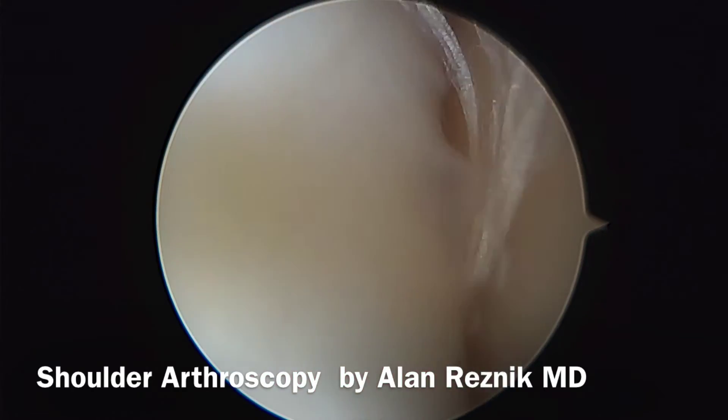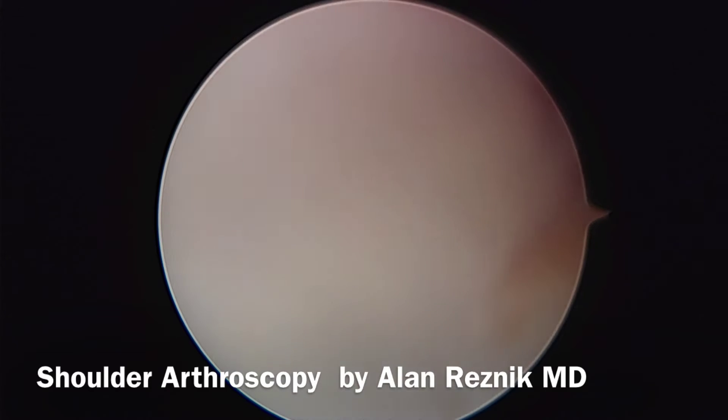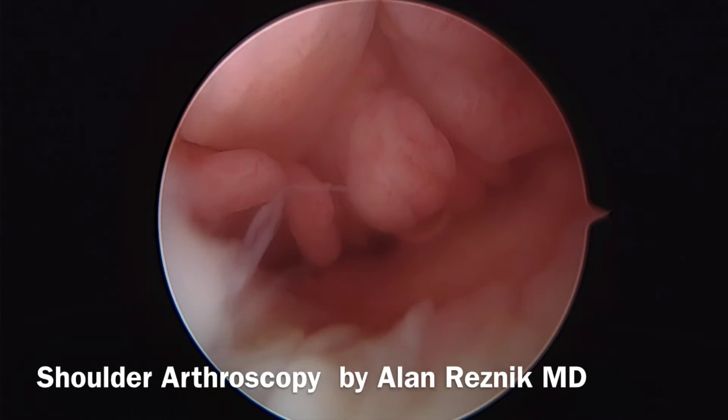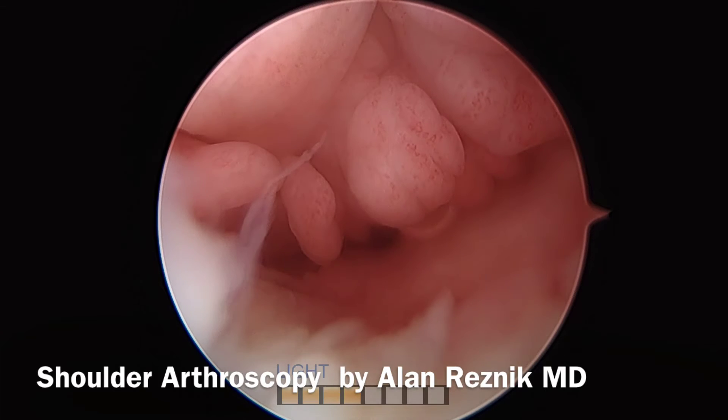I'm going to look up, follow the biceps again, and come to the rotator cuff — and there is a gap there. With a little traction on the shoulder, we can see there is a hole, and that's most likely a chronic rotator cuff tear.